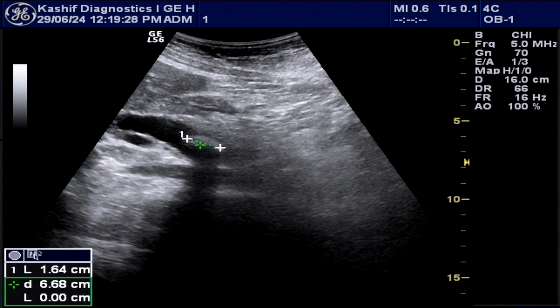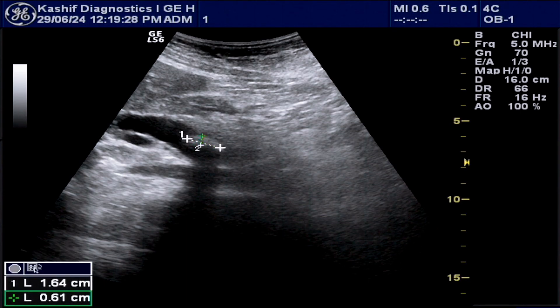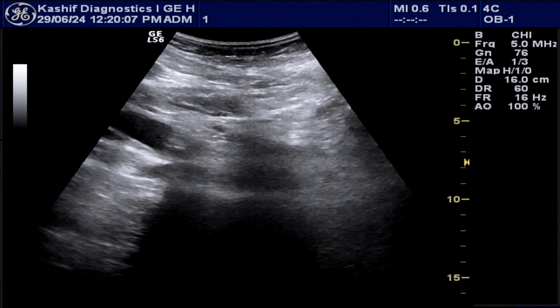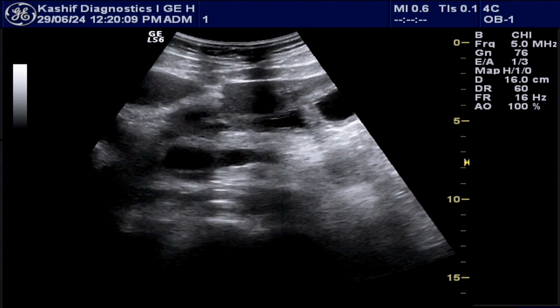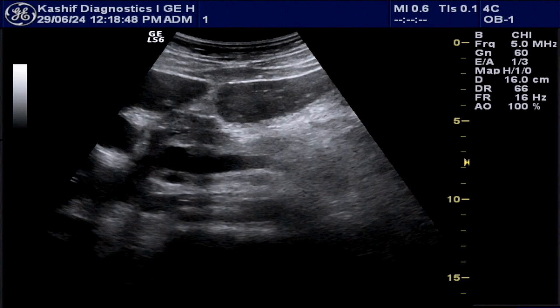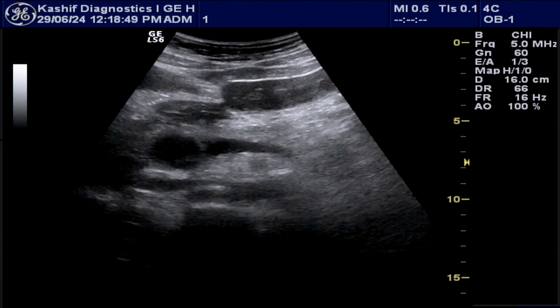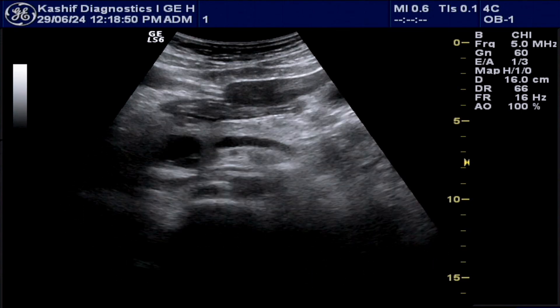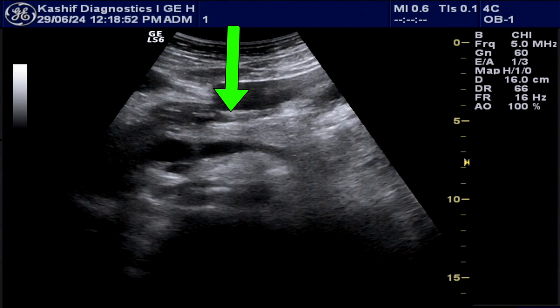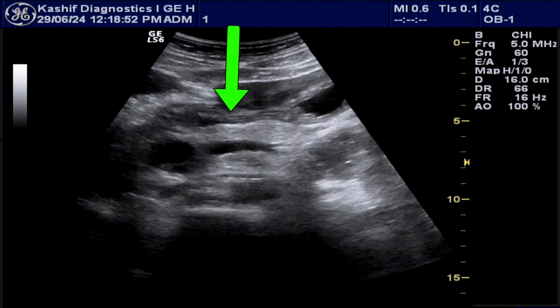Gallbladder diseases are mainly female diseases, but many men are now getting gallbladder diseases and most of them are overweight. The pancreas must be properly visualized in this case. The pancreas is anterior to the splenic vein and is normal in this case.